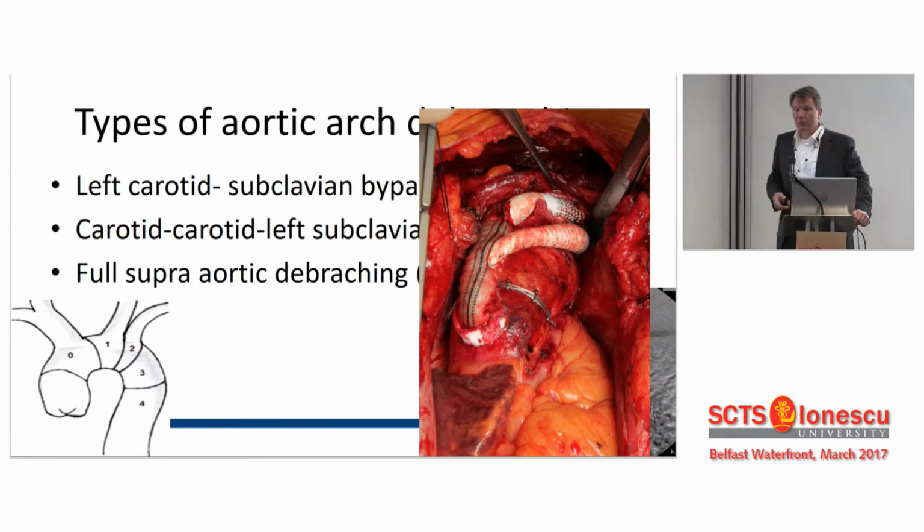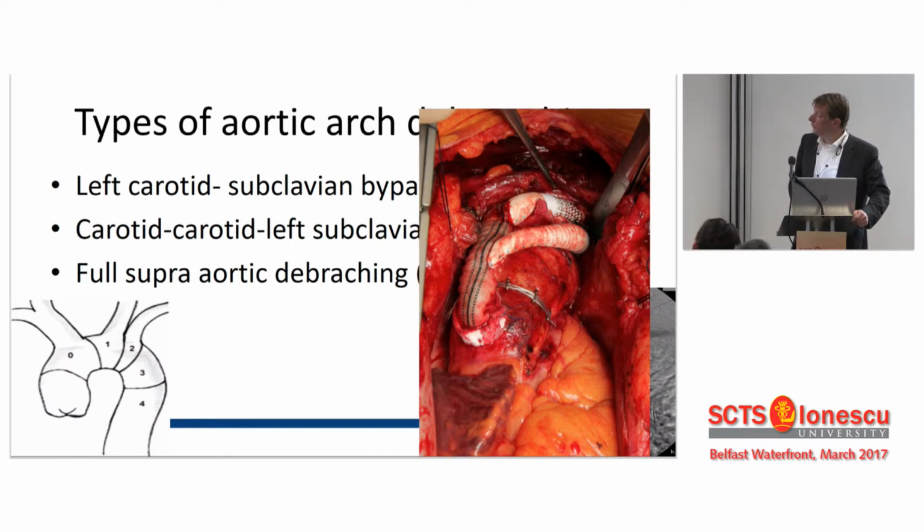Yeah, probably for you guys it's a small operation, but I think it's much more invasive than the other options. And in my opinion, it's usually difficult to reach the left subclavian artery. So if you use this kind of hybrid graft, it's much easier to revascularize all patients. And you can also use a pacemaker wire to temporarily mark your proximal landing zone for your stent.